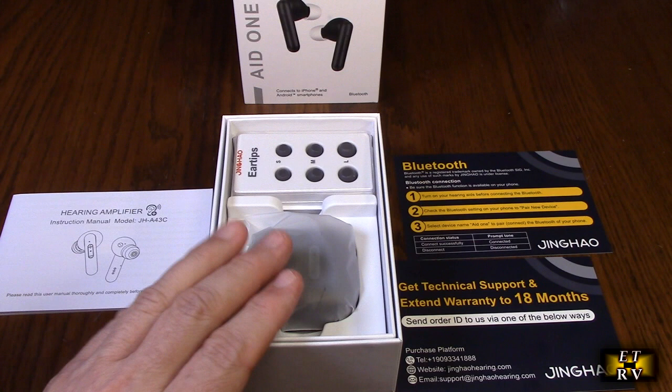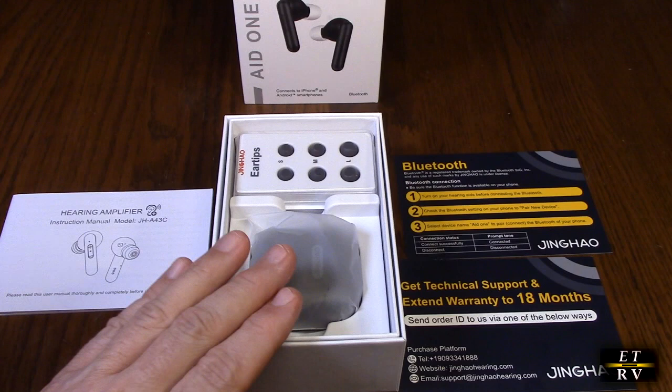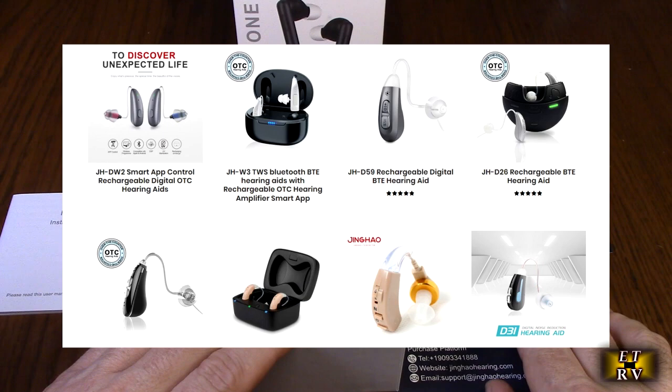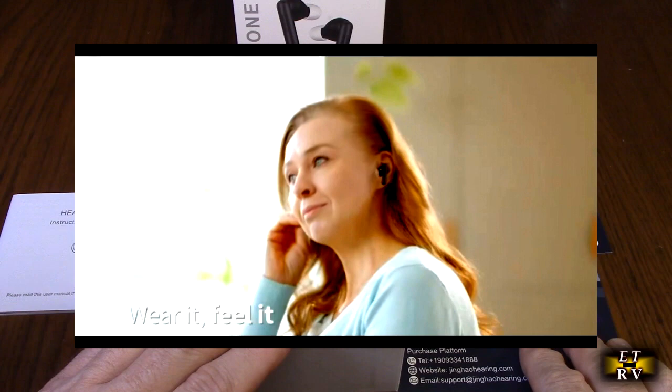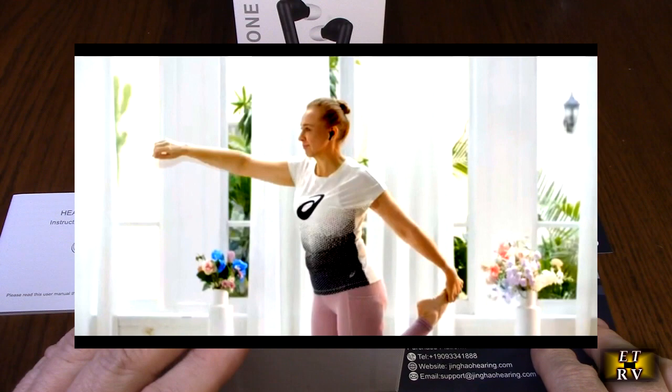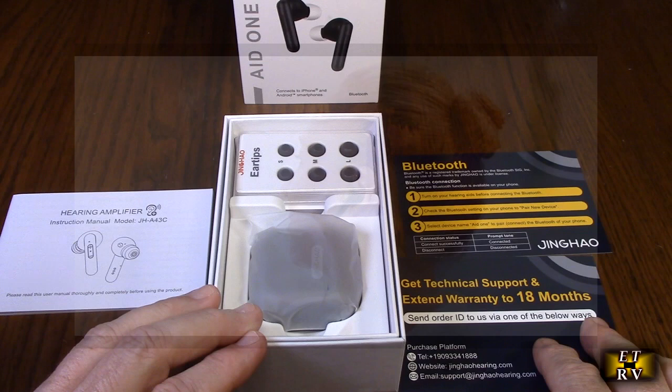There are a lot of different hearing aid companies out there, and this company is different because this is a unique product. They have a dedicated customer service hotline and email for after-sales support. This is a professional hearing aid design and manufacturing company established over 10 years ago. The Aid 1 is an FDA-certified OTC over-the-counter hearing aid with Bluetooth capability, allowing it to connect to your mobile phone or other Bluetooth devices.